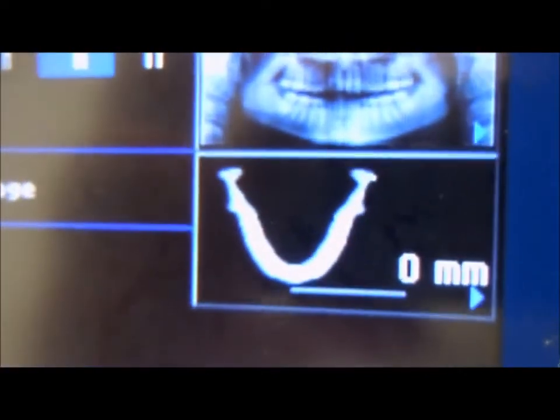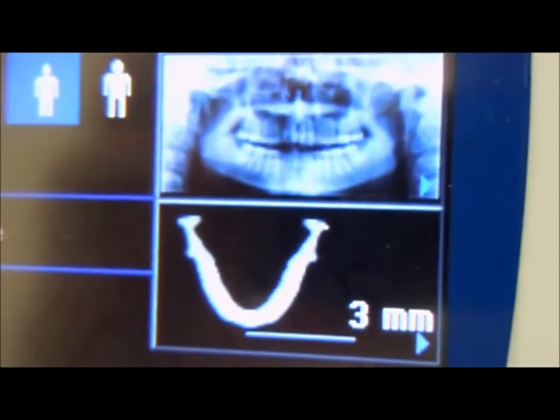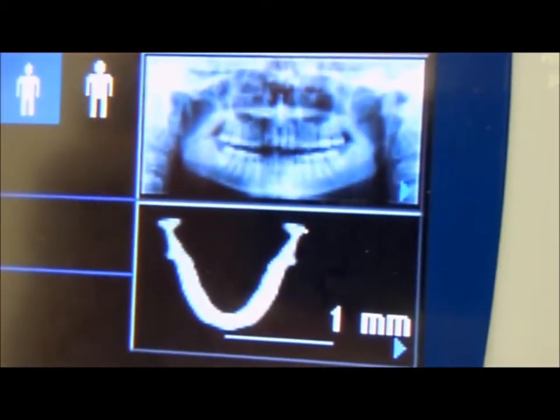As I'm moving the laser, it's changing on the display — 3, 2, 1 millimeter. We want it set to 0 millimeters. That's 0 millimeters.